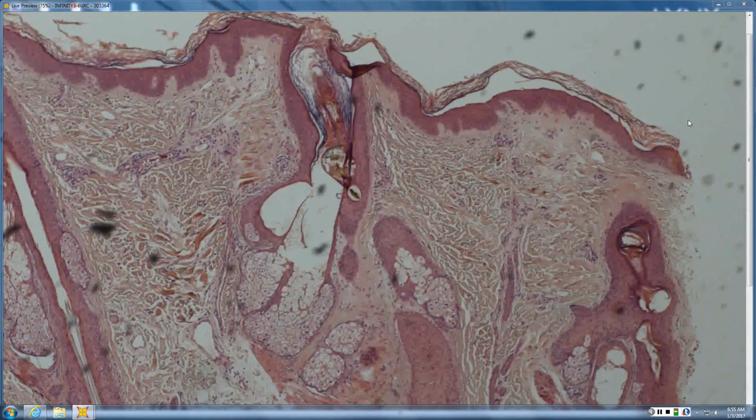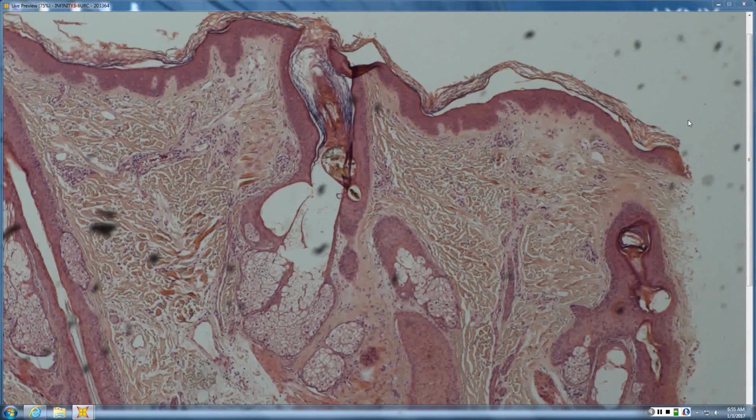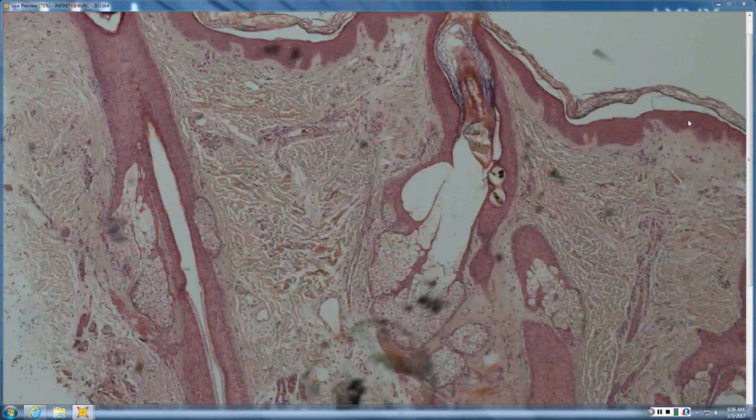There is still one here, so there's still a hair. It looks like there's still a hair in here, but in this follicular unit, it doesn't look like there's really hair left in there. Here, the hair shaft is gone. They've been pulled out, and so these follicles have been distorted and damaged, and you get that trichomalacia, and you see the pigment casts. So that's pretty good for trichotillomania or traction.